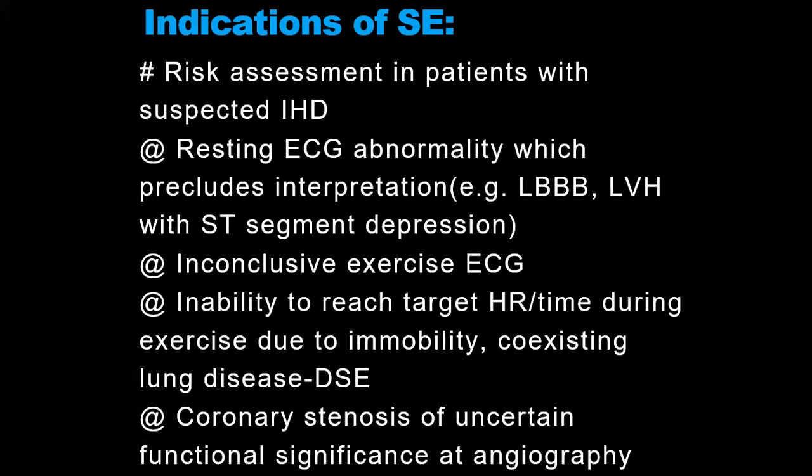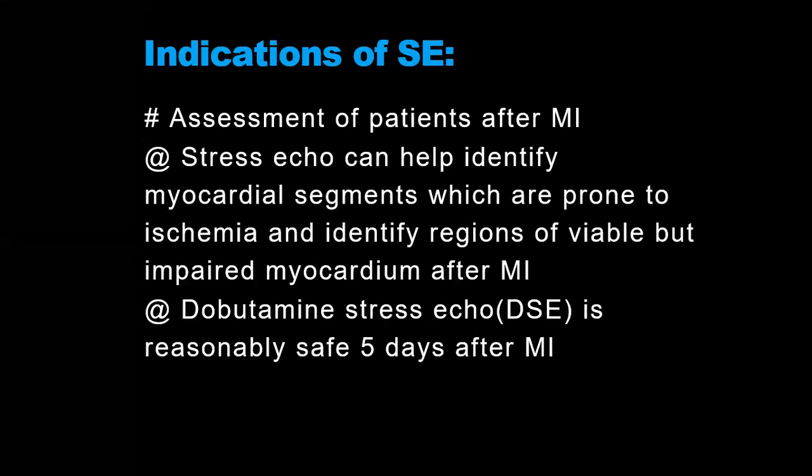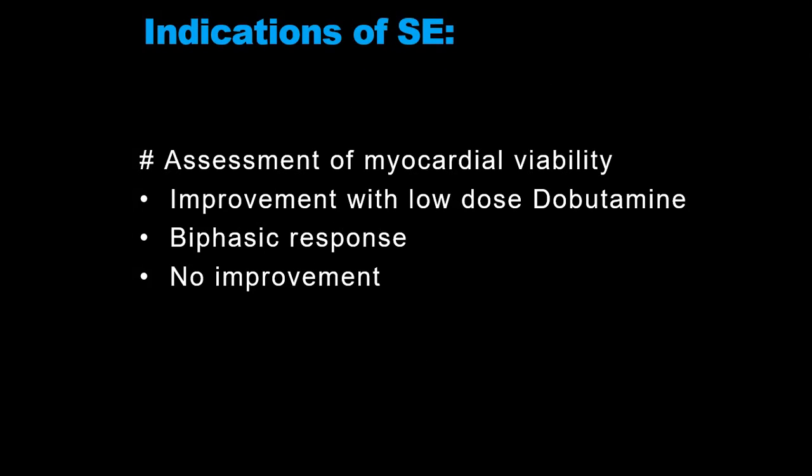Coronary stenosis of uncertain functional significance at angiography. Assessment of patients after MI. Stress echo can help identify myocardial segments which are prone to ischemia and identify regions of viable but impaired myocardium after MI. Dobutamine stress echo is reasonably safe 5 days after MI. Another indication is assessment of myocardial viability: improvement with low dose dobutamine, biphasic response, no improvement.